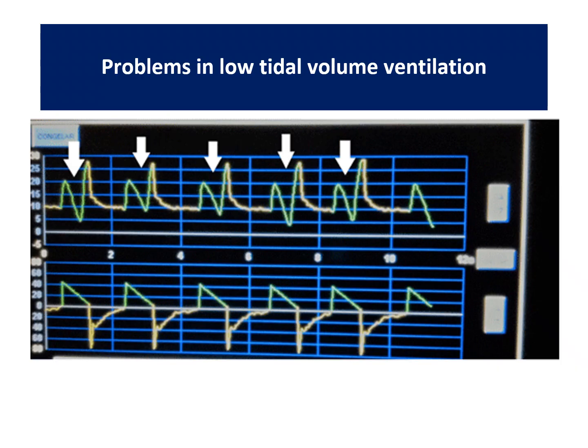So basically, this is the pressure curve, and you can see that there is a dip in the pressure during inspiration itself. This is happening because the patient wants more flow. Okay, so either flow or volume is what you have to increase. You cannot increase the volume, so you can increase the flow in volume control ventilation. So this is the flow asynchrony. The patient requires more flow than what you are giving, and you can increase the flow.